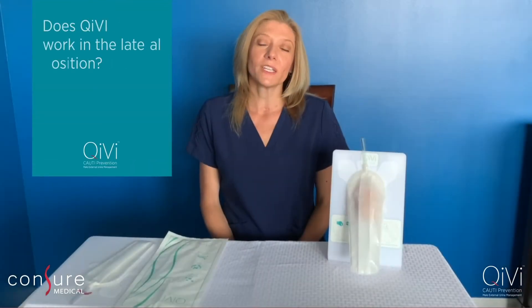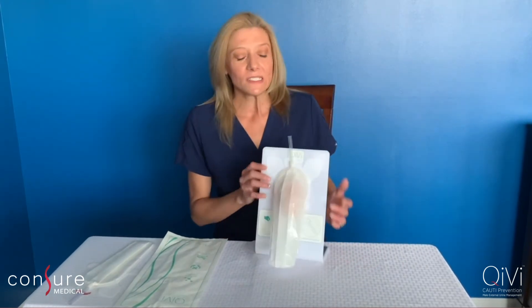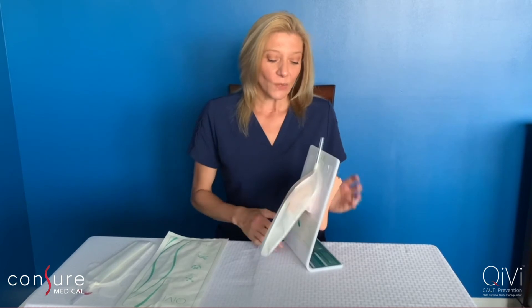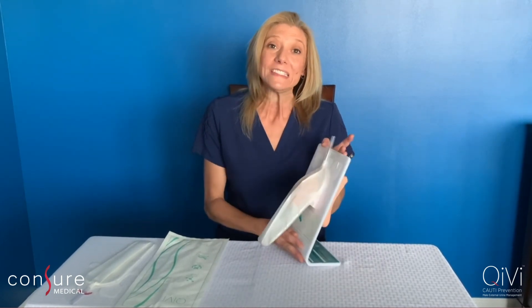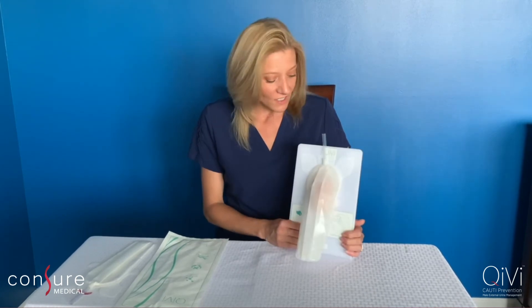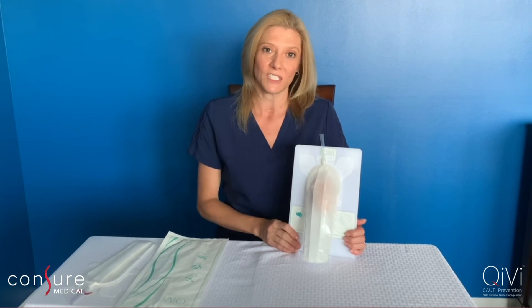Can Kiwi work in lateral position? The answer is yes. Kiwi is a completely closed system, so it can work in lateral, supine, and even seated position. In fact, as long as Kiwi is connected to the suction canister, you can use Kiwi in many positions.